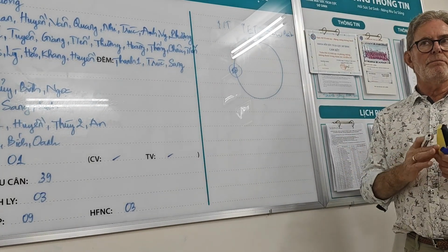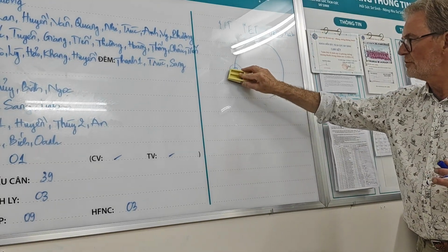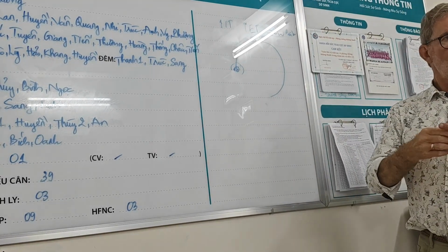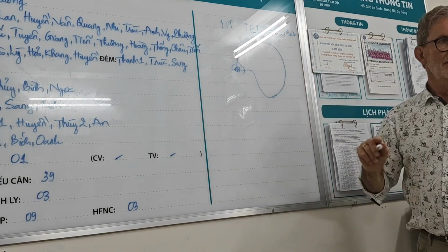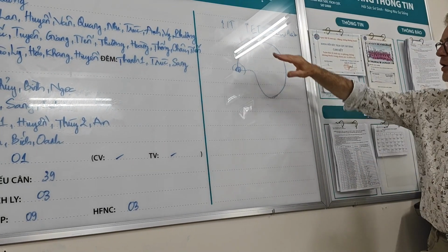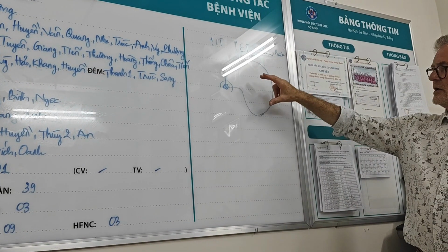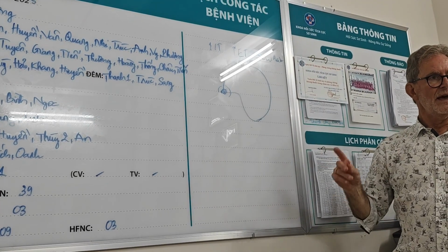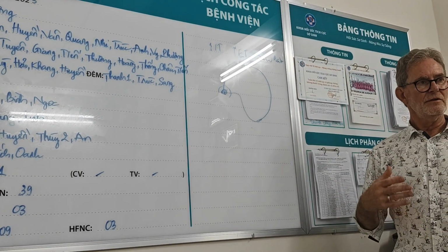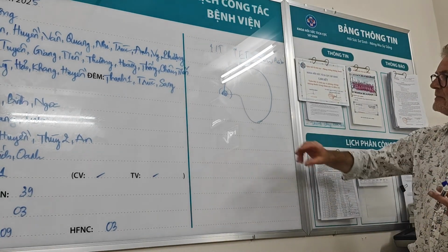If you've got bronchomalacia or airway collapse as your primary problem, what happens is you see this. So long before the lung is completely emptied, you lose flow because the airway collapses. And that's the hint that you've got bronchomalacia or airways collapse.